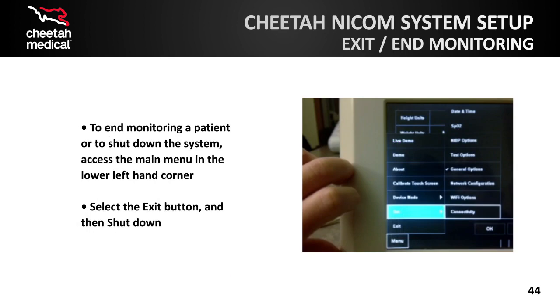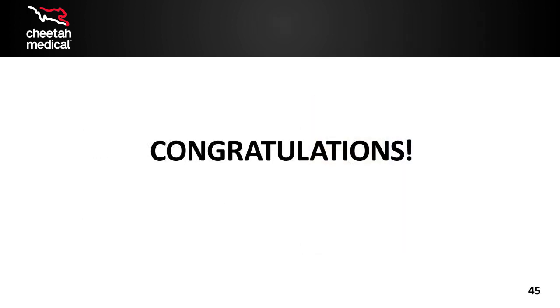To end monitoring for a patient or to shut down the system, access the main menu in the lower left-hand corner. Select the Exit button and then Shut Down. Congratulations! You have now finished the course.